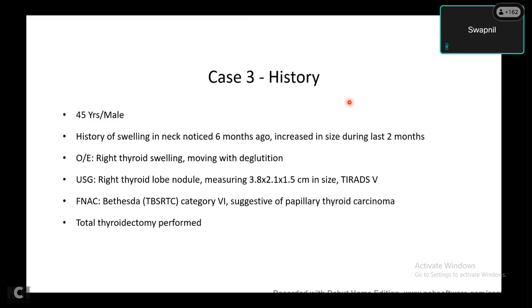Right. So this is obviously not a discussion on the FNA part of it. This is beyond the FNA. This is focusing more on the histology and the final diagnosis. And one point that is probably helpful is whether there is a multifocal disease or a single nodule. Madam, would you offer a diagnosis of multifocal, invasive encapsulated FVPTC if it is a multinodular disease or multiple nodules of the same thing? Or would you rather offer it as an infiltrative follicular variant of PTC?